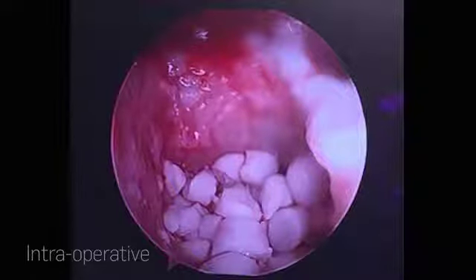So at that point, we used the local antibiotic administration with vancomycin and tobramycin. We knew the sensitivities of our organism, and it was vancomycin sensitive. In order to manage the dead space, we used some of the STIMULAN beads in order to manage the large defect in the tibia. And actually the picture that I have included there is the arthroscopic photo of when I had the arthroscopic camera inside the knee joint looking down into the tibial defect. You can see that dead space, how well it was filled back with the beads to control the dead space as we treated locally with antibiotics.